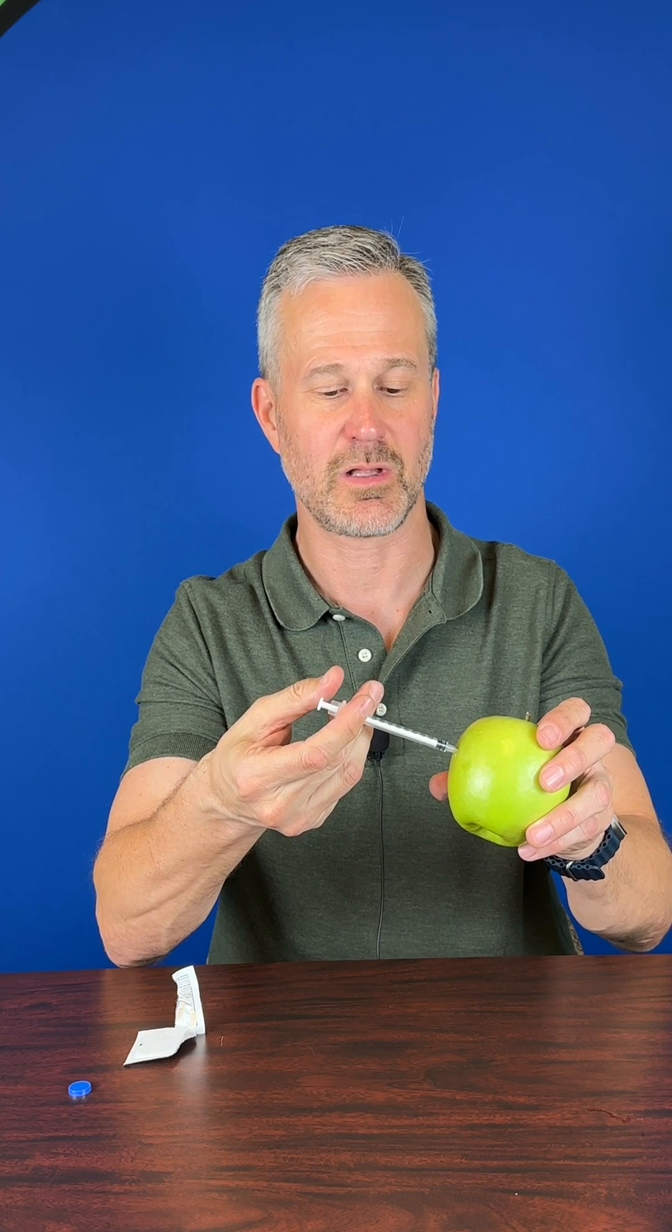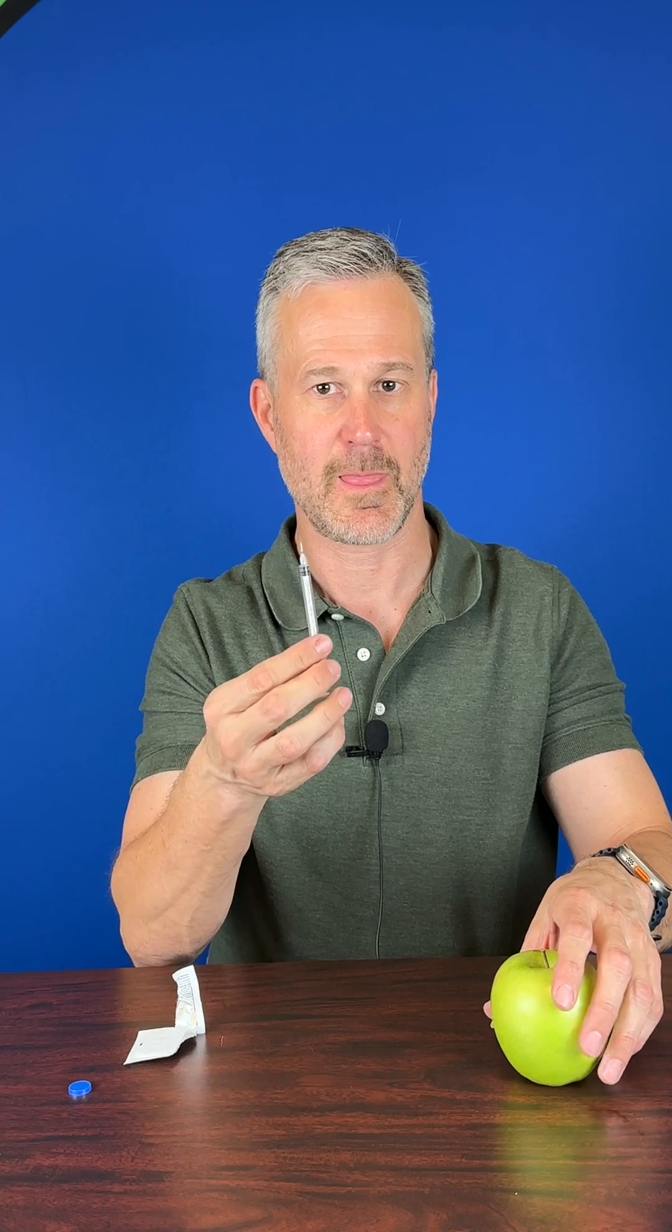Once the medicine is all the way in, pull the syringe out. Dispose of your syringe in a hard plastic container or sharps container as directed.